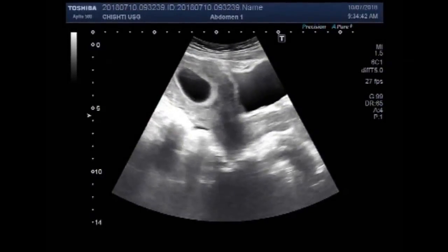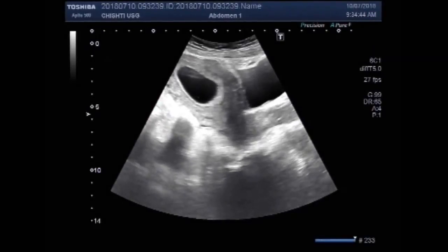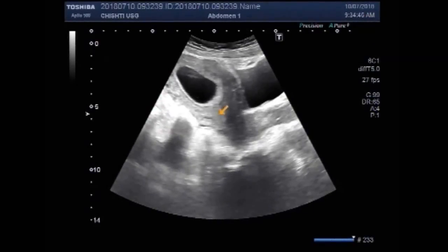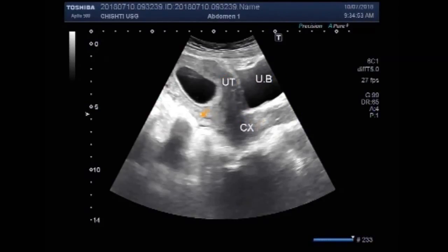You can see the uterus having a gestational sac. This is the urinary bladder, this is the uterus, cervix, and gestational sac.